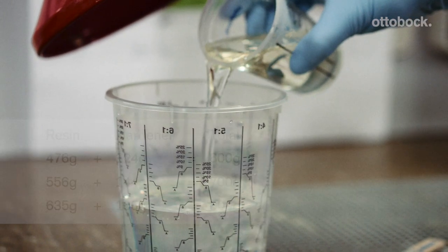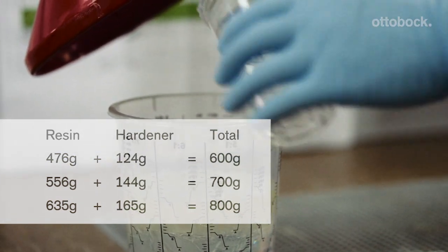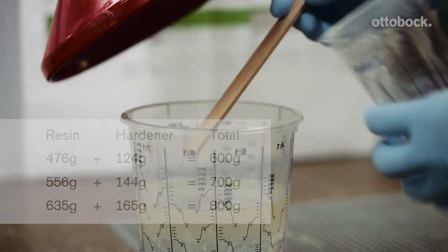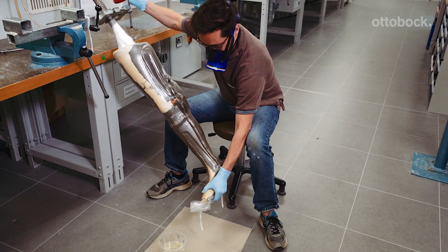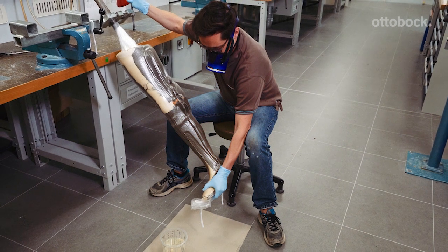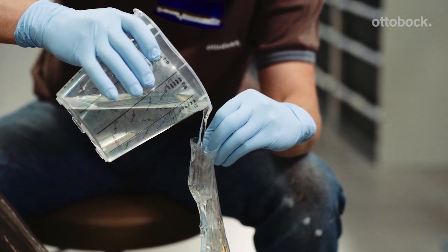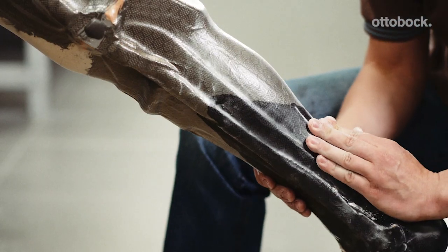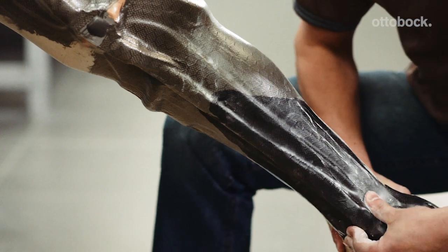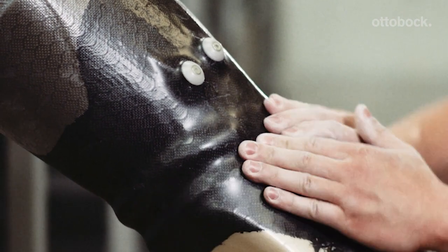When preparing the amount of resin, make sure to use the precise ratio by mixing 100 parts of Orthopox resin with 26 parts of Orthopox hardener. Adjust the position of the model in the vise such that air can be extracted upwards. Pour the prepared resin into the PVA bag. The Orthopox resin can be processed for approximately one hour. Beginning at the foot and working your way upwards to the thigh shell, massage in the resin slowly, ensuring all fibers are thoroughly saturated.